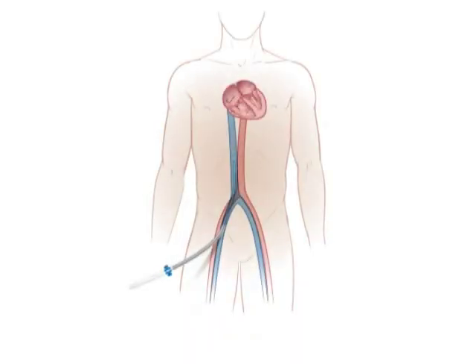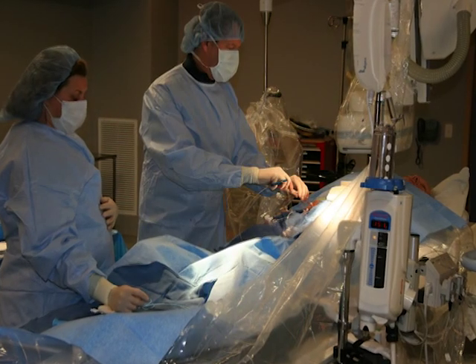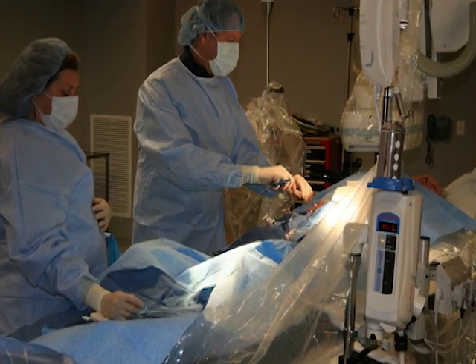In cardiac catheterization, a thin, flexible tube called a catheter is inserted into a blood vessel and threaded through it into your heart. Cardiac catheterization can be used to examine your arteries and heart valves, or to measure how well your heart is pumping. Your doctor can also use devices at the tip of the catheter to treat artery or valve problems. Other segments explain specific treatment procedures. Here, we'll focus on what happens before, during, and after any cardiac catheterization.